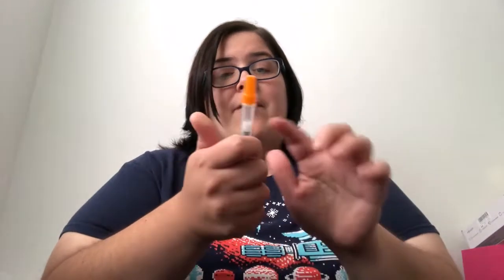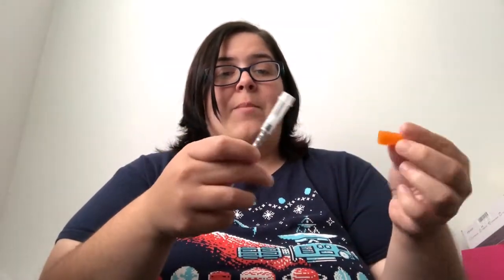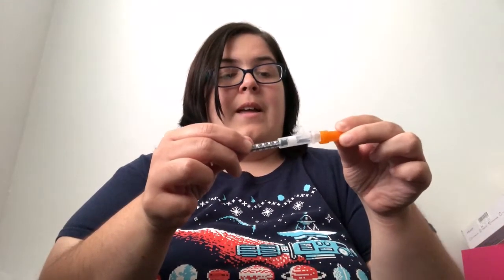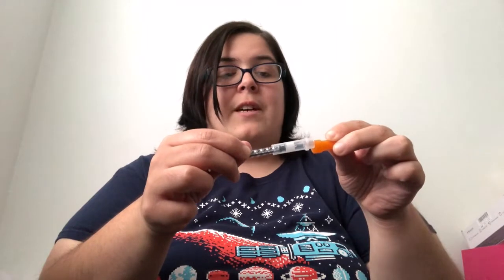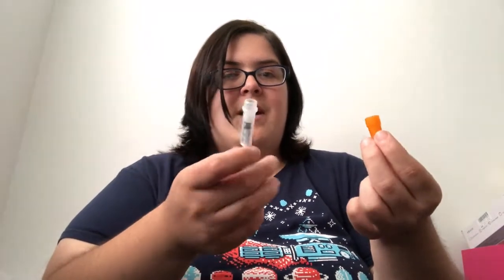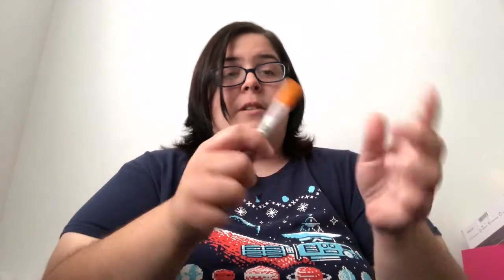What they taught us in nursing school is once you have this up, throw it away. Don't even bother trying to recap it, because you could be trying to recap it and you're having issues and it goes down like this, like I'm showing you. So don't do it. It's not worth it. And why would you want to stick yourself?